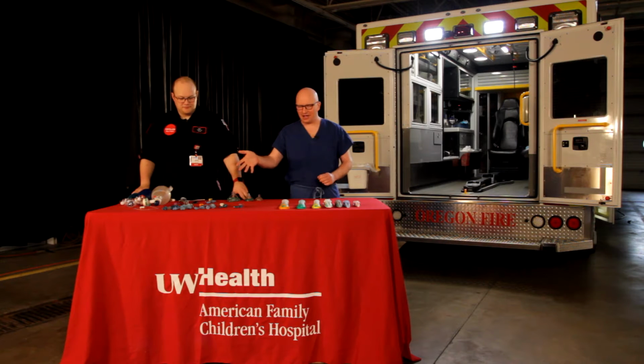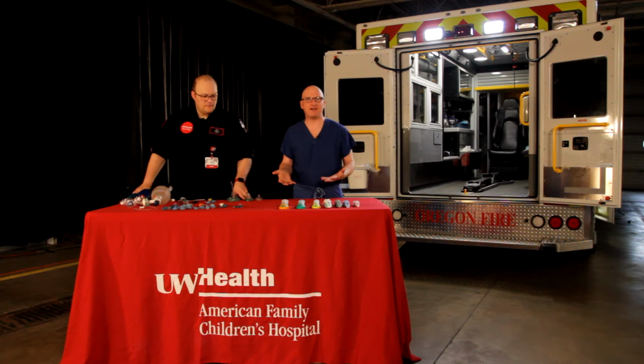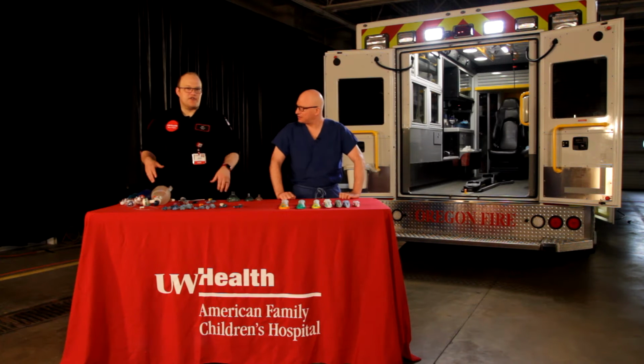Let's talk now about the two most common supraglottic airways that we have available. Absolutely. So supraglottic is just a way of saying we're not going to place anything below the vocal cords or through the glottis.